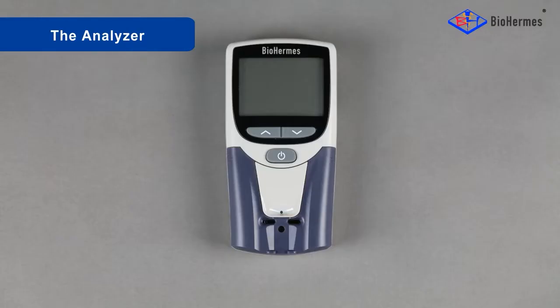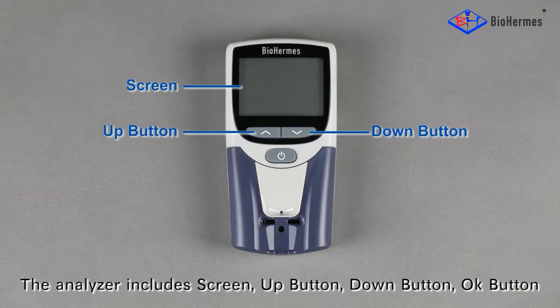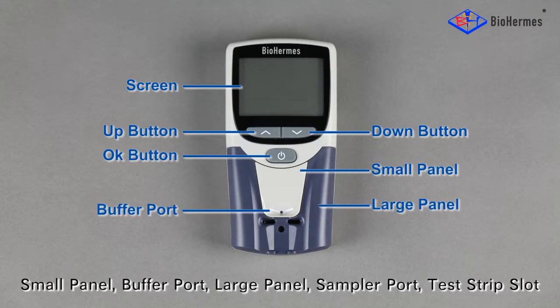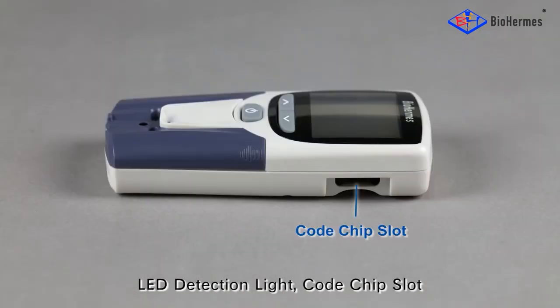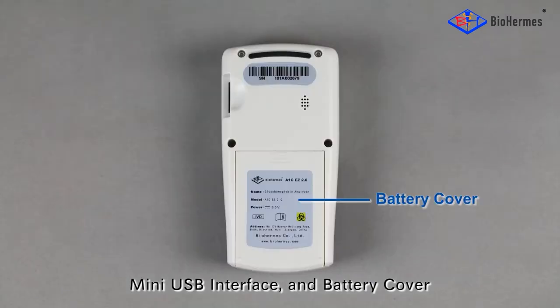The Analyzer includes a screen, up button, down button, OK button, small panel, buffer port, large panel, sampler port, test strip slot, LED detection light, code chip slot, mini USB interface, and battery cover.